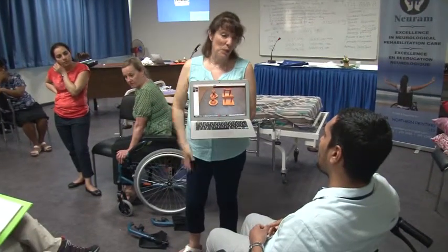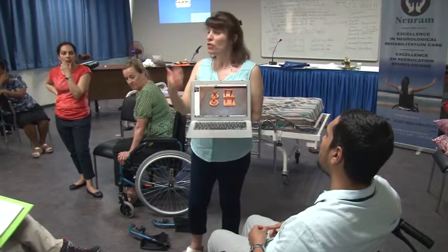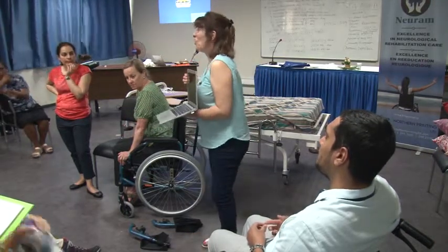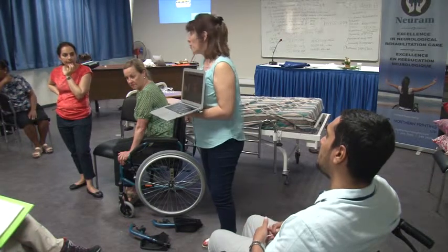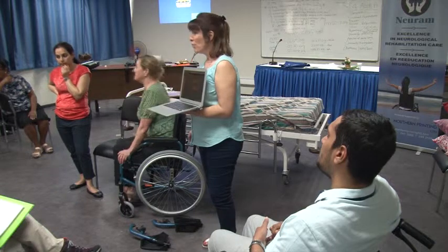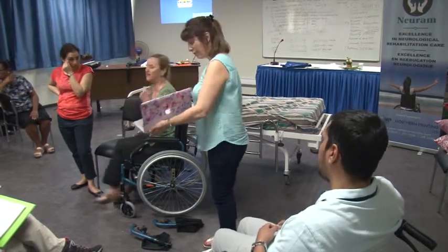We like these because they work for us. Yeah. For our tetraplegics, the mushroom blocks are really good. You can find, but just think, you could use, just be creative. But there's somewhere to think about if you know that something, and it just makes such a difference to your lift. It gives you really good clearance. I need to buy it. Yeah, remat. Oh yeah, remat.